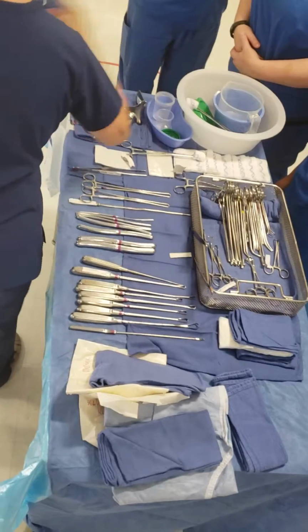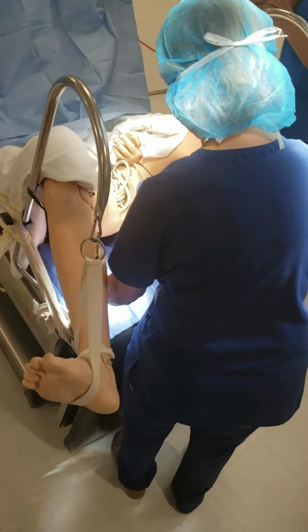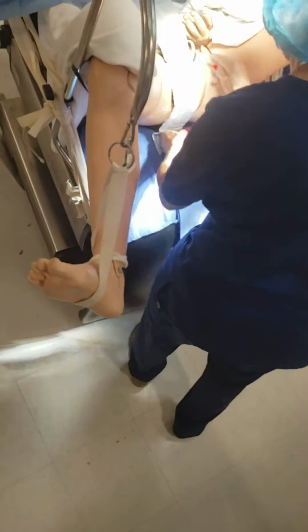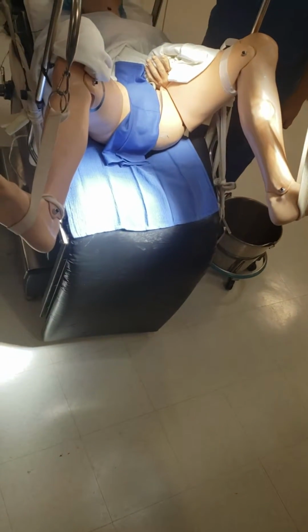Okay, so then I would take a wet towel and I would wipe her off all over, all the betadine and stuff. Then we would put the peri pad on and we would put this over it. Then it's time to raise the table up.